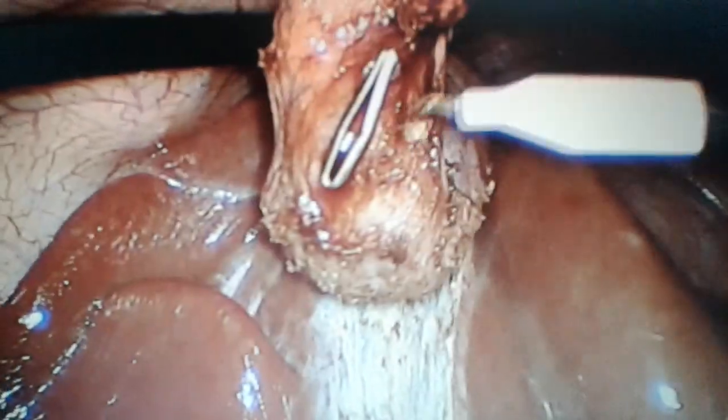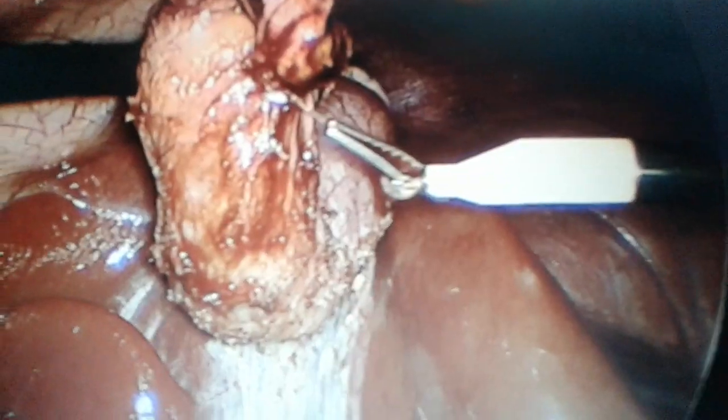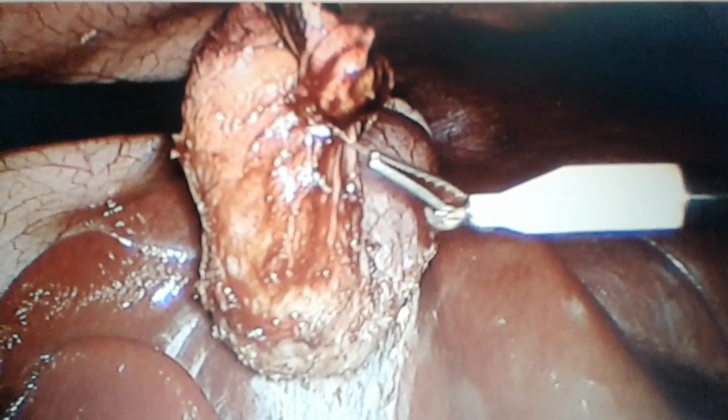Now see, one complication is there waiting for you, right? And what is that? Displaced clip obstructing the cut end of the gallbladder. So what to do? Now what to do according to you? You just write your comment in the chat box.